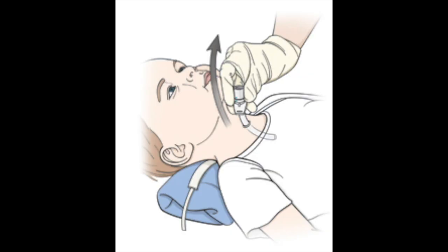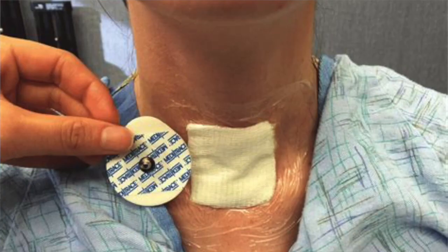If the patient has no difficulties with the overnight capping trial, then the tracheostomy tube is removed the following day. The stoma is covered with gauze. The patient should be observed for another 24 to 48 hours to make sure the patient is able to breathe comfortably and is able to cough and clear respiratory secretions.